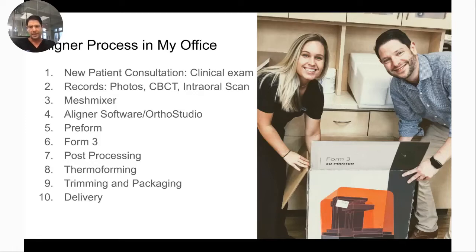And then that's where you digitally set up the case, determine how the teeth are going to move, what attachments you're going to place, whether or not you need to do interproximal reduction, and then stage out the models. Once you stage the models out, you export those files. With those exported files, we'll print using PreForm software. And one of the best things about Formlabs is just how user-friendly the printers and the software are.